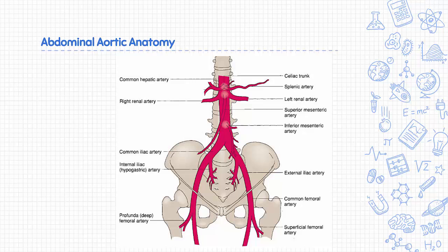There are several main arteries that branch off the aorta. Identification of these arteries is not particularly useful in rapid assessment, so we're not going to spend a lot of time on them. But remember, 90% of aneurysms occur below the renal arteries, which is why scanning the entire aorta is crucial. Although not pictured here, remember the inferior vena cava runs down the right side of the aorta. Be careful not to mistake the IVC for the aorta on exam. We'll discuss some tips and tricks for differentiating the IVC from the aorta in a minute.